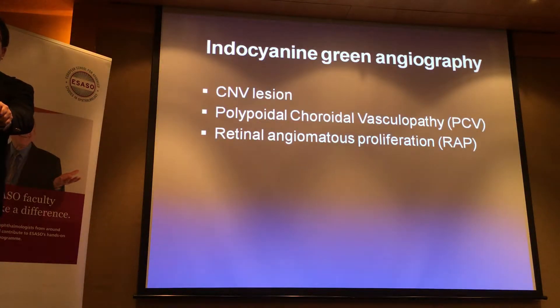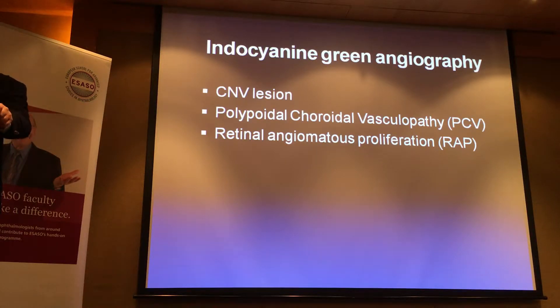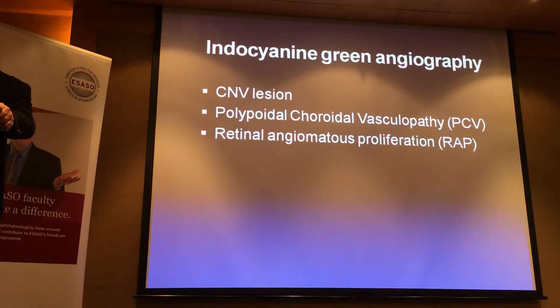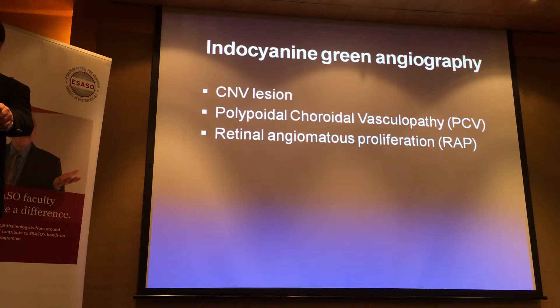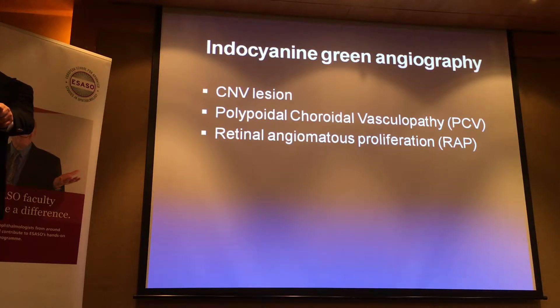ICG angiograms — as you know, ICG has less leakage from the choroidal capillaries, and hence it stays inside the vessels, making it better for imaging choroidal vessels. This is certainly useful for CNV lesions. You can see the branching vascular network, and you can see polyps — the gold standard for PCV. Even things like RAP will be more clearly seen.